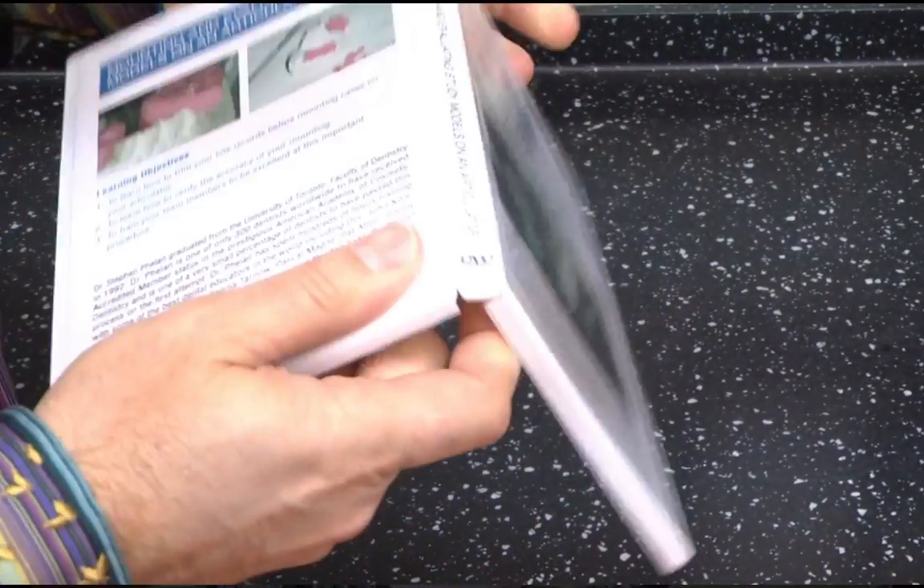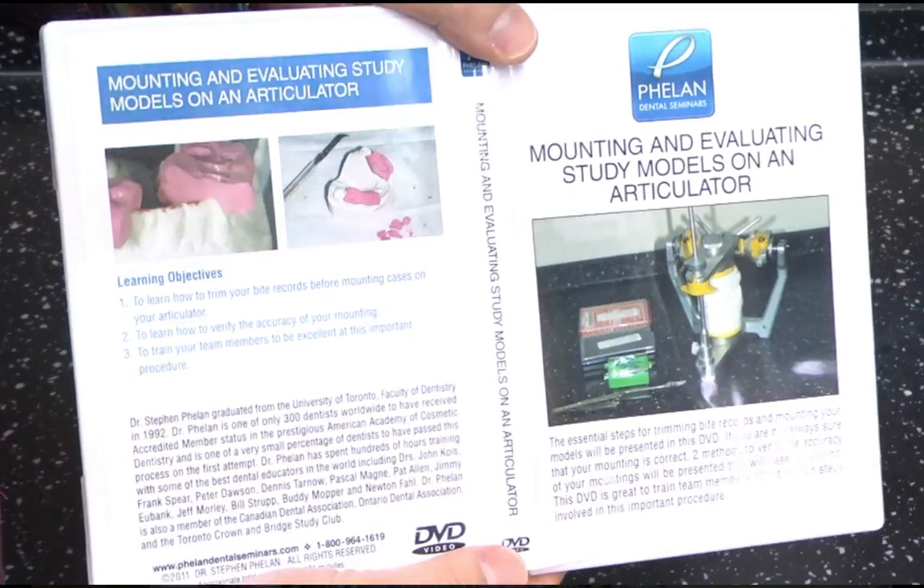The next DVD is 'Mounting and Evaluating Study Models' — about two hours long on two DVDs. I demonstrate in detail the protocol for mounting study models and using the MPI. I go through a model analysis — what to look for on the models and how to analyze your mounted models to evaluate the patient's occlusion. Another valuable DVD if you're interested in occlusion and more complex dental cases.